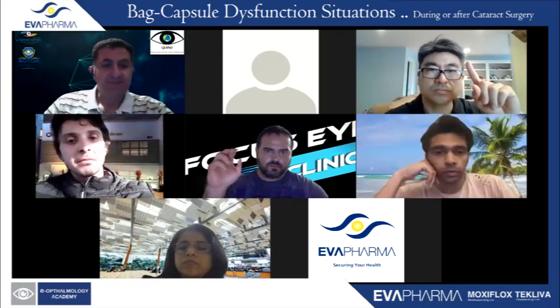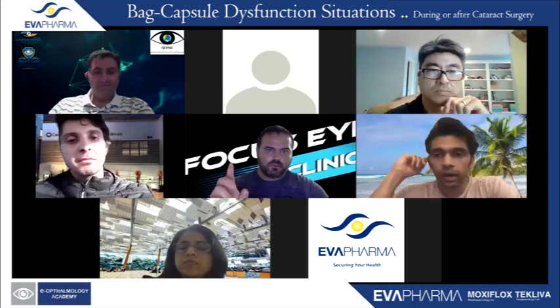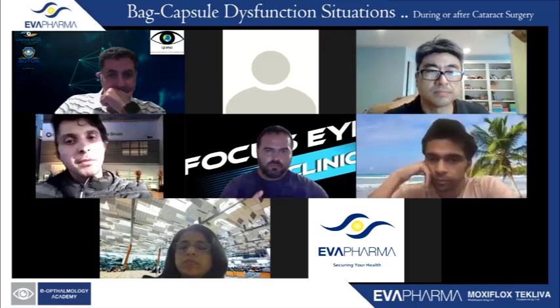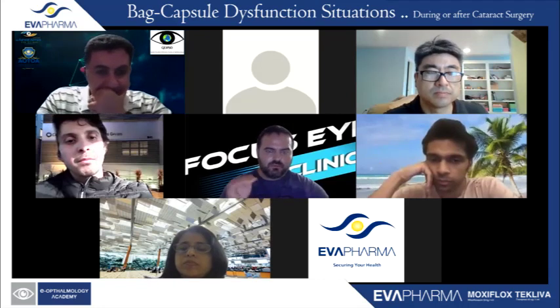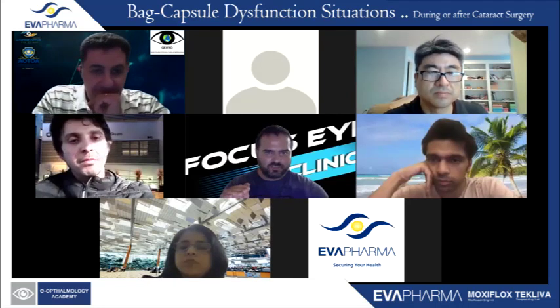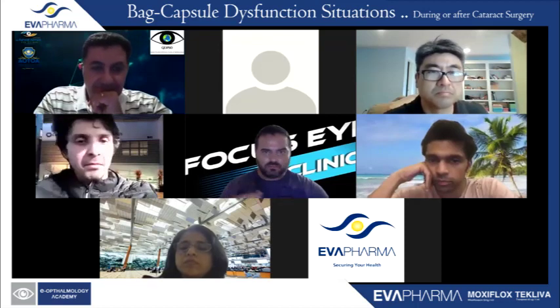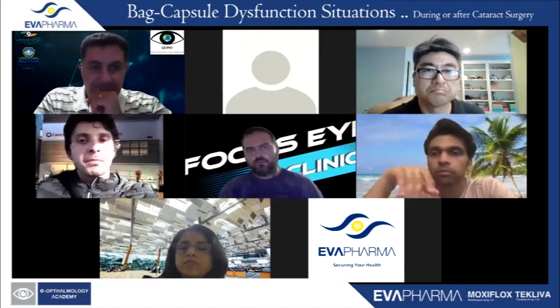Lukan, go ahead, Lukan, and Brian. I can comment on the question of Dr. Armia. It's really stable, and when you do a fluid air exchange there is no issue with sclerally fixated IOLs at all. I can guarantee that.